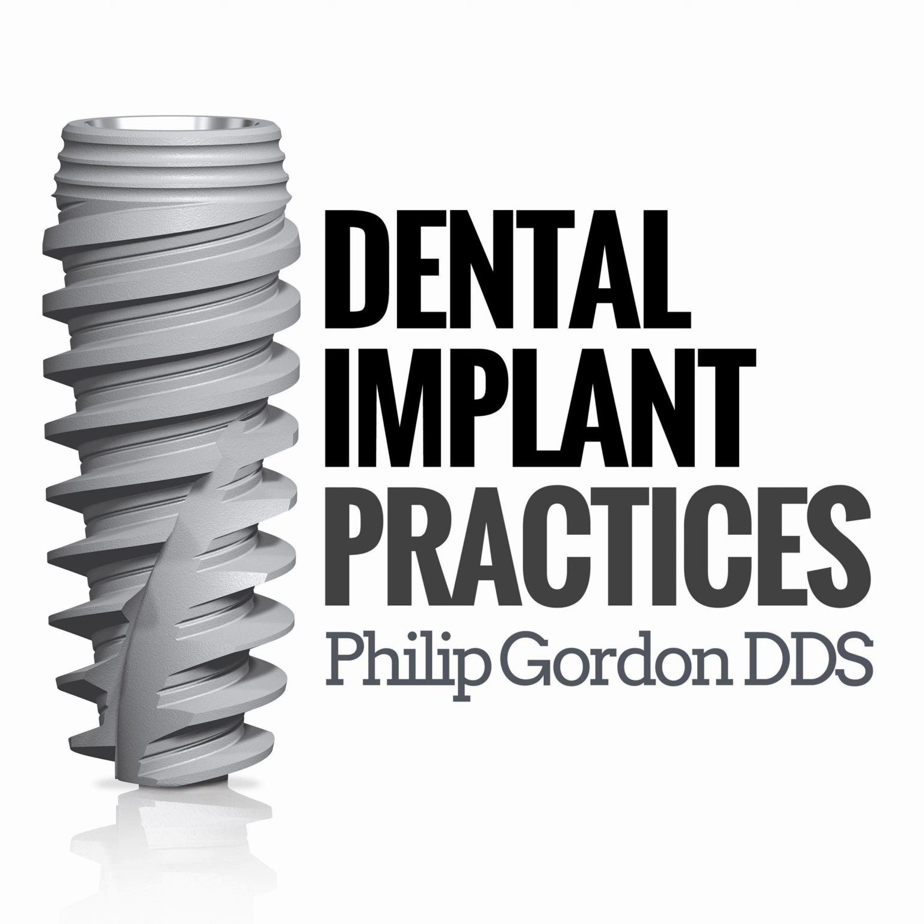For ridge preservation after extractions or for bigger grafts, a lot of times I'll use, in addition to the particulate bone, a Teflon membrane. The polytetrafluoroethylene membrane is, I think, a really nice membrane. It protects the graft well. And if it should become exposed intraorally, if you get a little wound dehiscence, it's generally not a big deal.